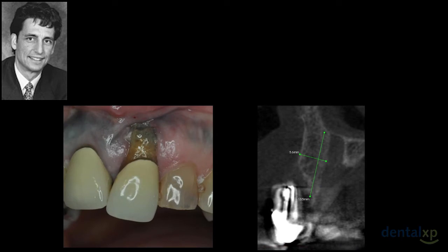So here's a challenging case. Is this an immediate implant case? Probably most people would say no. What about if the patient said, I've got a wedding to go to, it's in 3 months, and I can't look like this. Obviously, you're not going to be able to stage it and go through that. She wanted to finish everything.